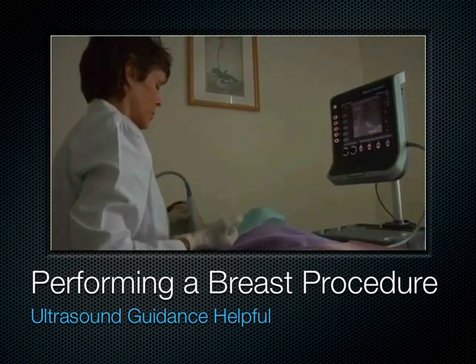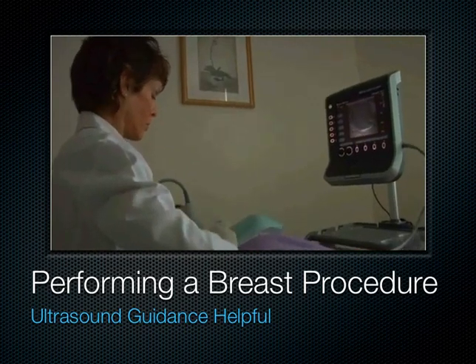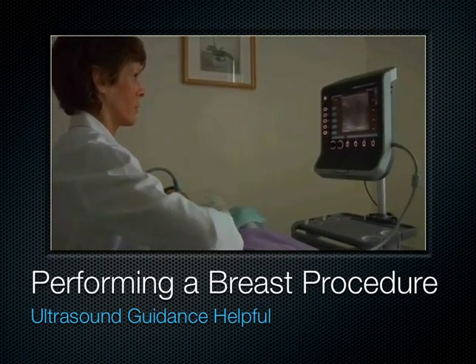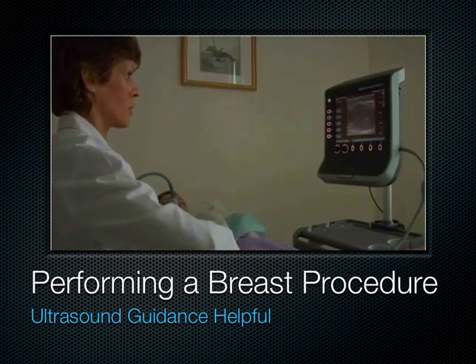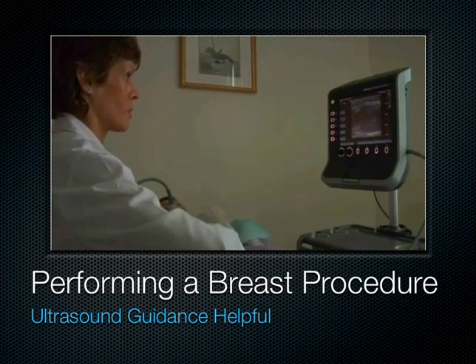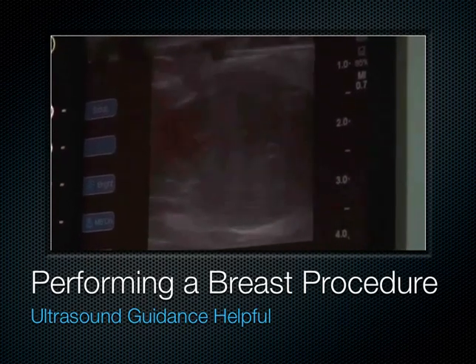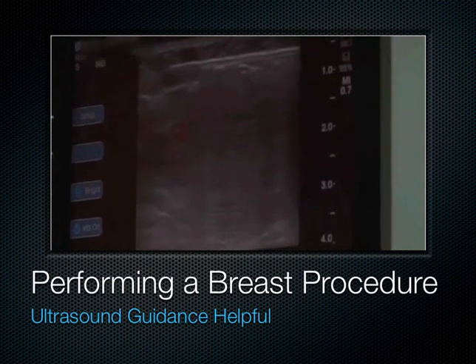And then I'm going to put some up over the top, which does two things. One is it gives us some numbing up top, but the other is see how close this fibroadenoma is to her skin. Once we start the freezing, we need to protect that skin, otherwise she's going to get frostbite, and then it sort of defeats the purpose of a nice cosmetic procedure. So in putting some numbing up here, it gives her the anesthetic effect, but it also drops that fibroadenoma down and gives us a little room for that ice to do its job.